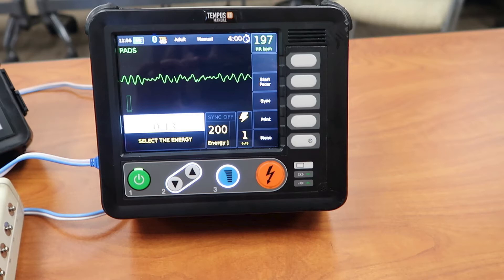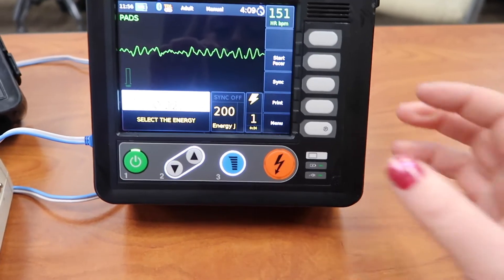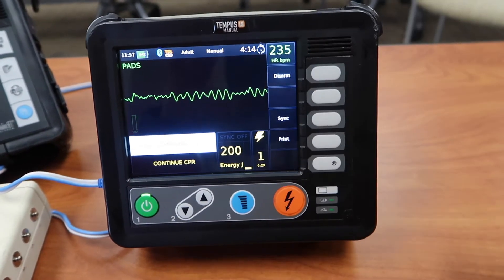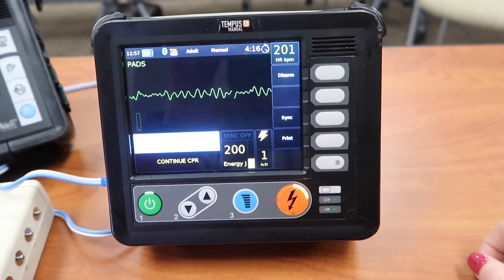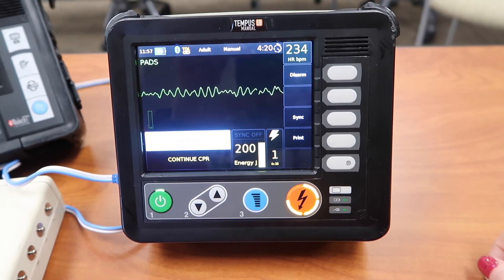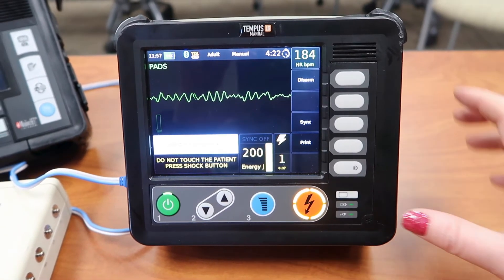Once you've decided that you want to deliver the shock, you're going to reach over and press that blue button. That blue button is to charge it. Once you press it, you'll start to notice that the orange button that has a lightning bolt on it starts to light up all the way around. You'll also notice right next to the energy that you selected, there's a little area that kind of fills up. Then there's a message to the left side that says 'do not touch the patient, press shock button.' The combination of the orange button, that little area next to the energy you selected, and the message tells you it's ready to deliver that defibrillation.